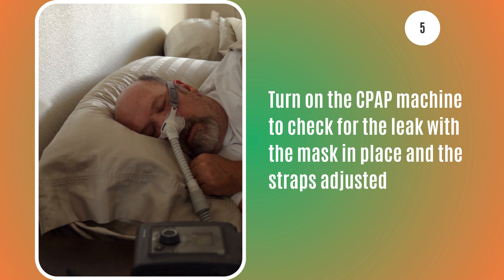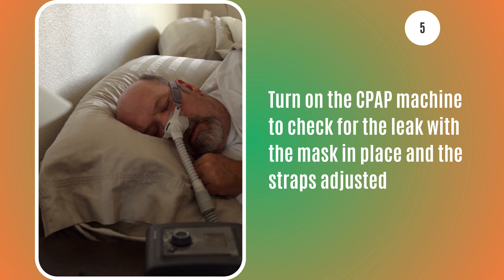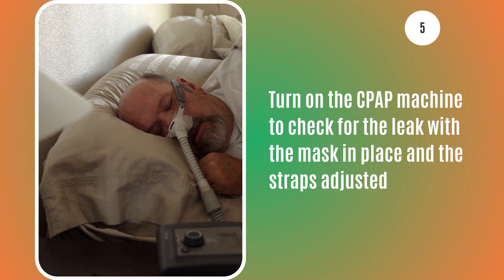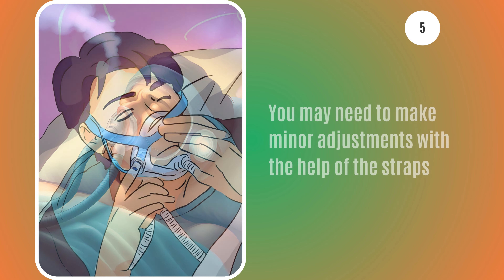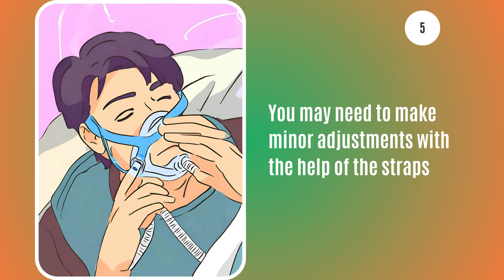Turn on the CPAP machine to check for the leak with the mask in place and the straps adjusted. As the air flows, check for any leaks around the mask. You may need to make minor adjustments with the help of the straps.